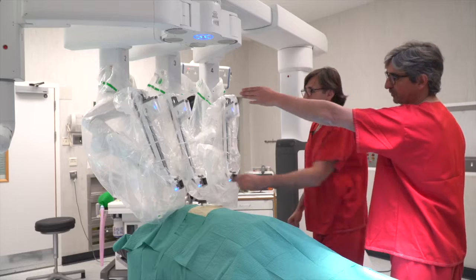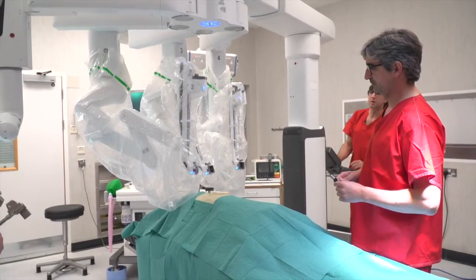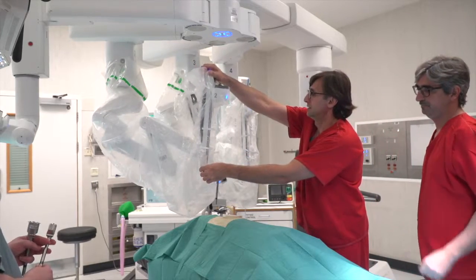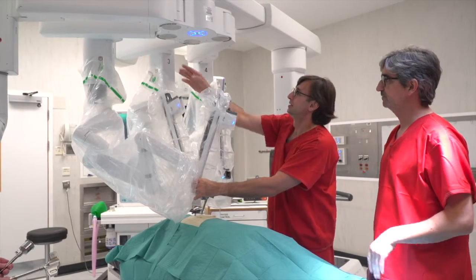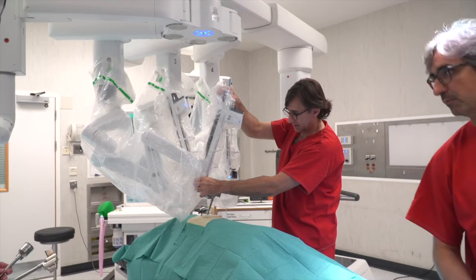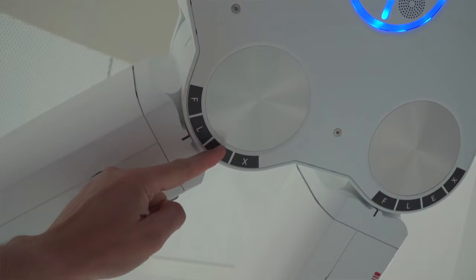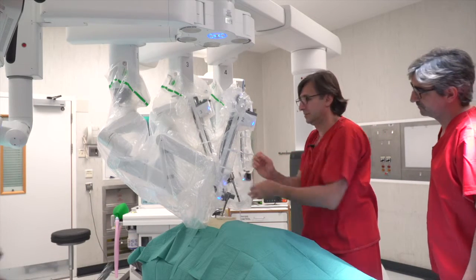Now we use arm two for the robot, for the camera. Arm two for the camera. Place the trocars. Maybe a little height — boom height. For the staplings, when I take out the stapler, there must be some space. No targeting — never. We don't do targeting; it's one of the things that makes this faster. The mark in the middle of the letter — this black mark should be in the middle of one of these. Either the first, second, third or fourth; it doesn't matter, but it should be in the middle, not on the left or right. In the middle. And the same with the others.